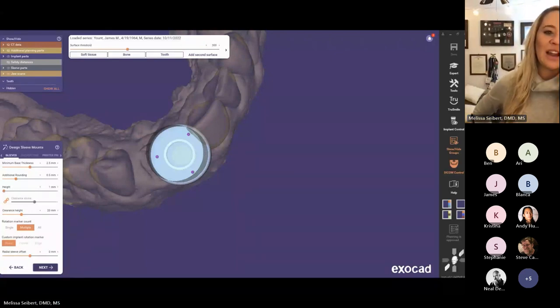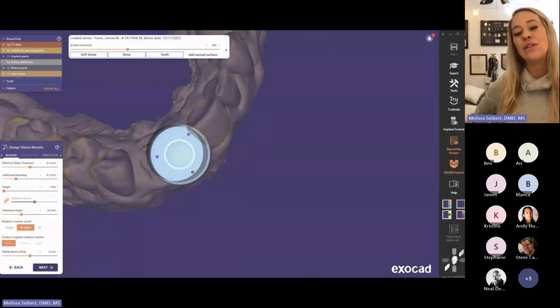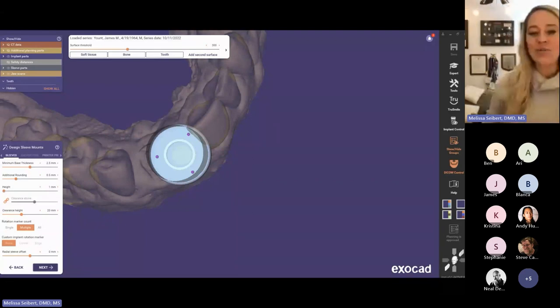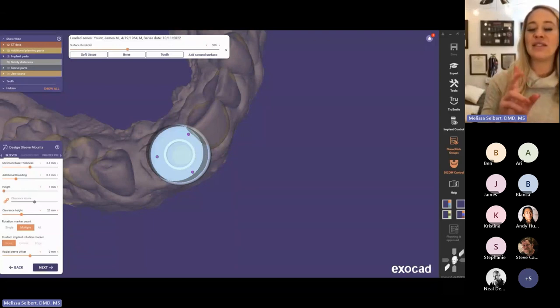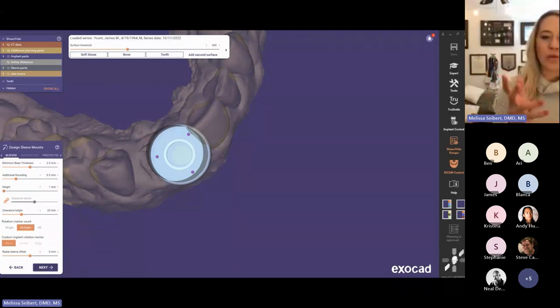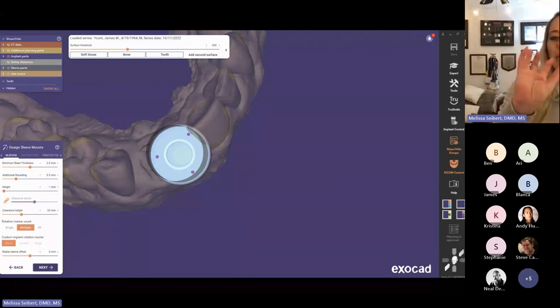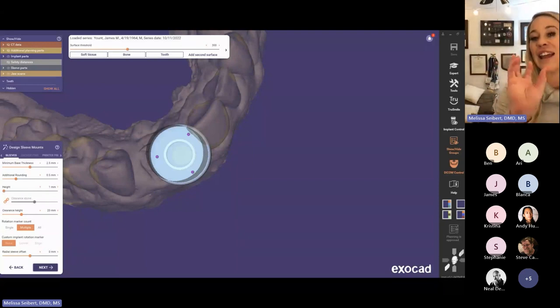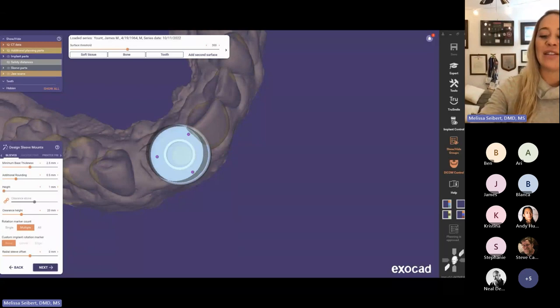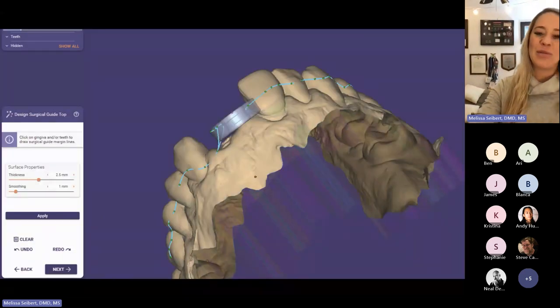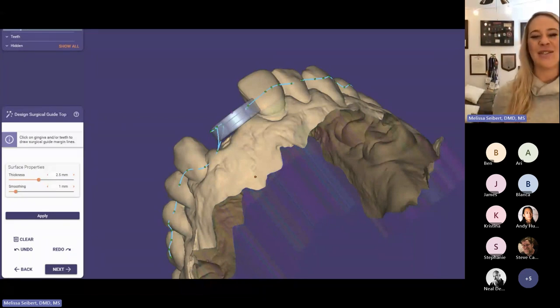With this feature, I'm able to put the rotational markers right onto the guide itself — those are what those purple little dots are. The rotational markers are implant-specific; some implants might require multiple rotational markers based on the design. This tells me precisely the rotation I need to end at so that delivery of my provisional is seamless — I just drop it right in. Also, 'plunking' is definitely not a technical term — you'll have to forgive me, but it just seems like such an appropriate word.